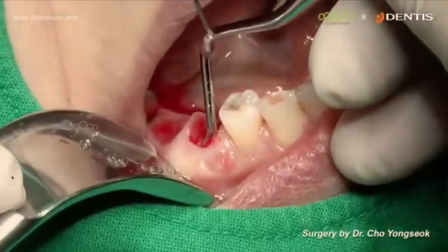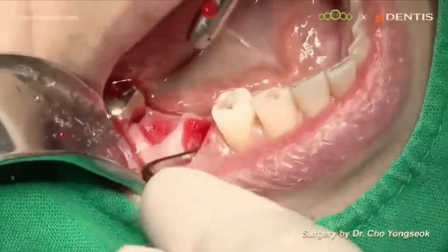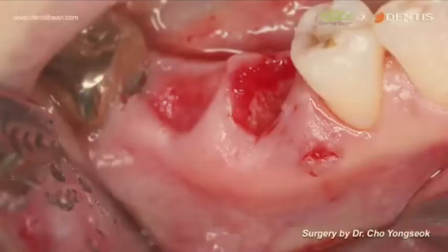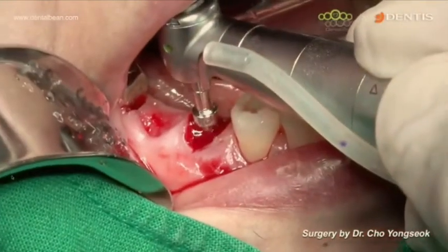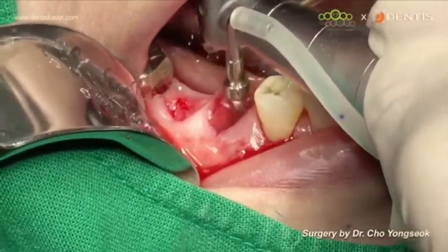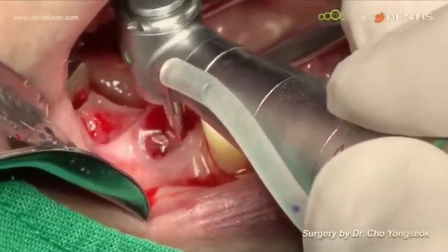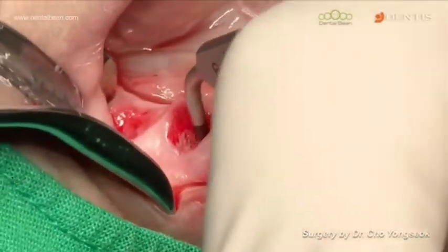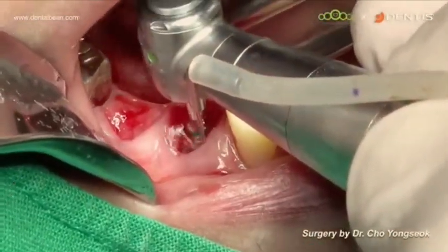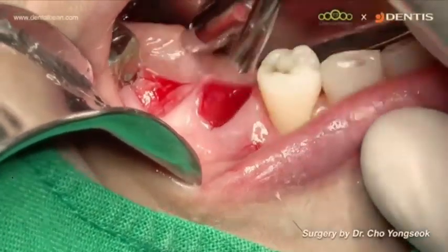Extracted the second premolar and buccal bone is lost like this. Okay, as you see, there was a fistula. I prepped the osteotomy at the center of the alveolar ridge. Center of the alveolar ridge, not the center of the root. Because the premolar root is positioned buccally, your implant must be positioned at the center. So the osteotomy should be done at the lingual of the extraction socket.